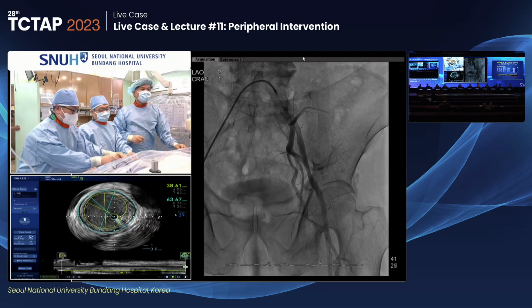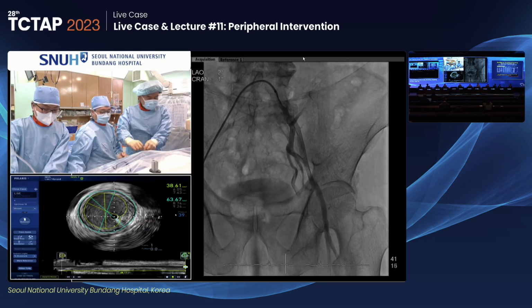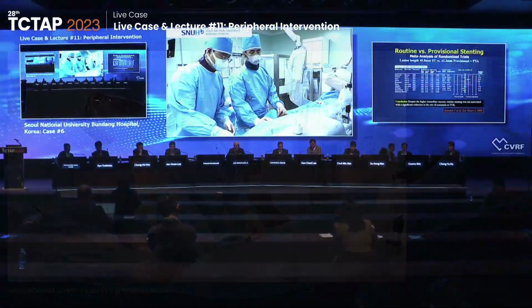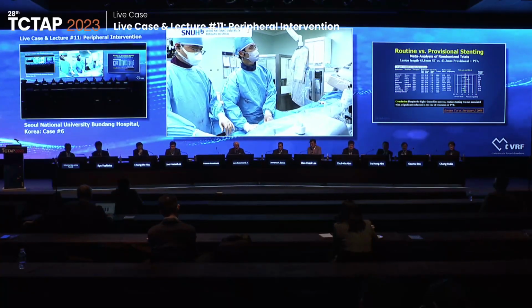We'll be back to see the final result. Thank you. Nice job, Dr. Ra. Thank you. We can transfer now to room 1. Hello. Yes. This is room 1, Dr. Yoon. Yoon, we're back with you.